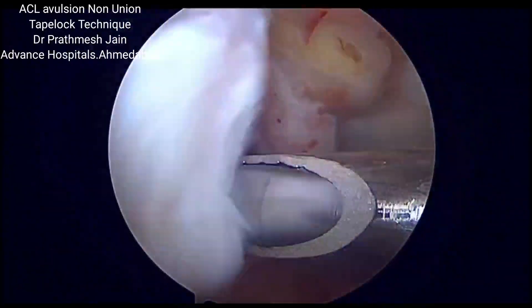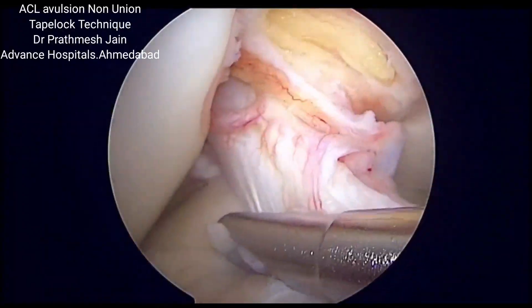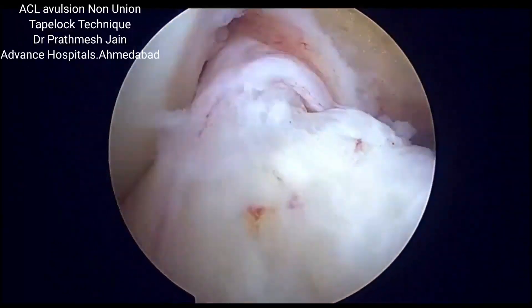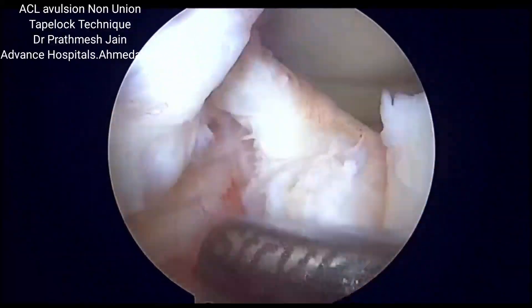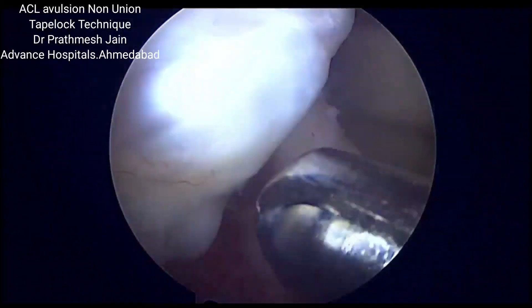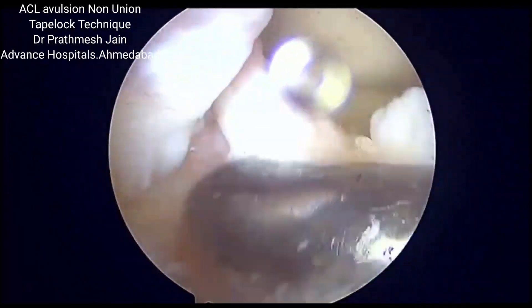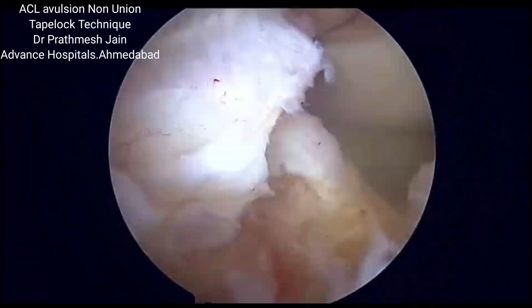We need to reduce, prepare the stump and repair it back to the crater so that we can reassertain the tension of the ACL per se. When we pull the ACL into the anteromedial aspect, the ACL stump and the fragment is reduced. We will use an innovative tape lock technique to reduce the stump and ascertain a proper healing of the ACL stump.